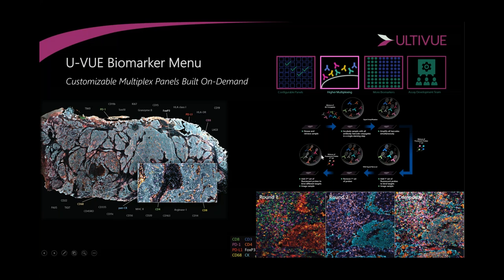And then we add in a second mixture of fluorescent probes, and these are targeting antibodies 5 through 8. And that's what you're seeing here in round two of imaging. And you can see this is of the same ROI. Now, there are various software options you can use to stack both of these images, and now you get a composite image where you're seeing all 8 biomarkers together.